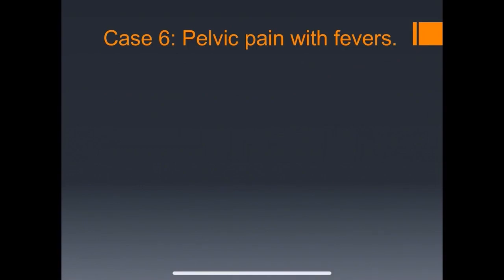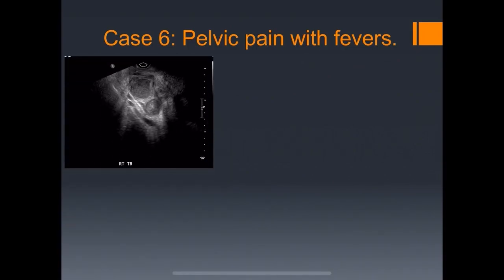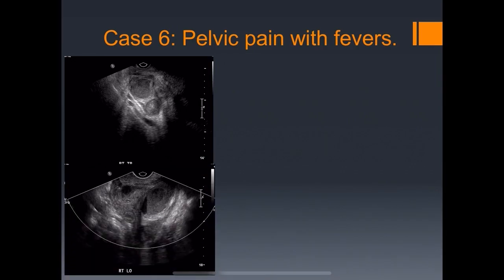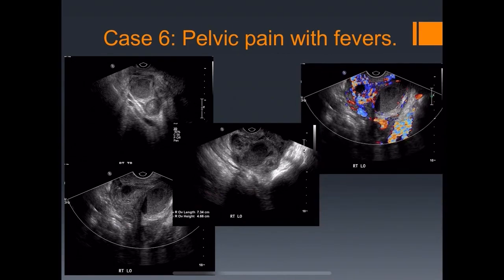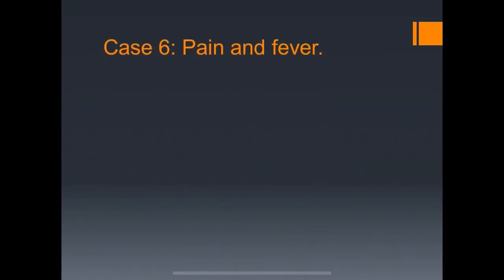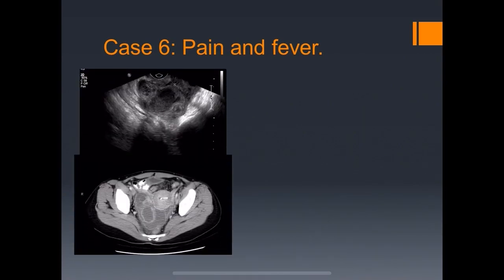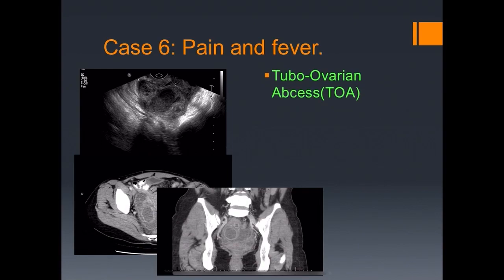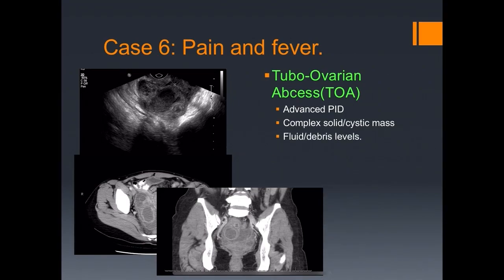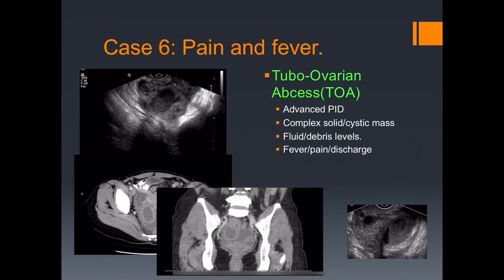Pelvic pain with fevers: the right adnexa shows multiple fluid-fluid levels, a large complex mass, and hypervascularity. On CT, an IUD is seen in place. This turned out to be a tubo-ovarian abscess — the IUD predisposes to PID. Features include a complex solid-cystic mass with fluid-debris levels, fever, pain, and discharge. Rupture with peritonitis can happen, so it's important to treat rapidly.